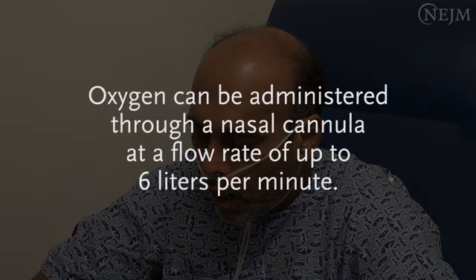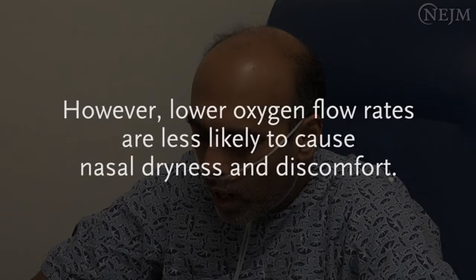However, an increase in minute ventilation, that is, the volume of gas inhaled or exhaled in 1 minute, or mouth breathing, can dilute the oxygen and result in a lower fraction of inspired oxygen, or FiO2. Oxygen can be administered through a nasal cannula at a flow rate of up to 6 liters per minute. However, lower oxygen flow rates are less likely to cause nasal dryness and discomfort.